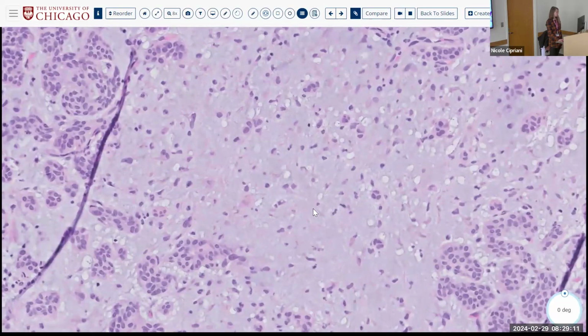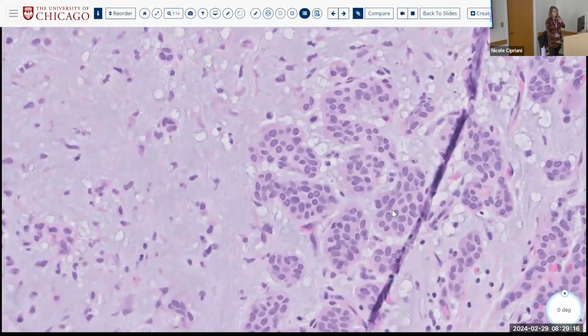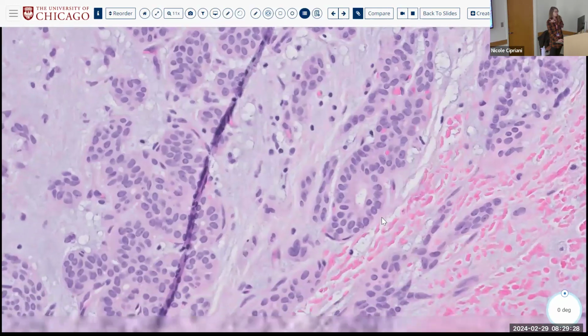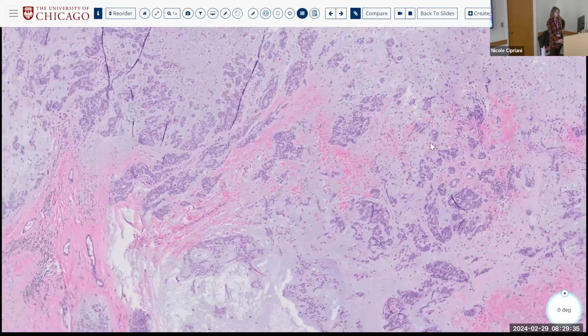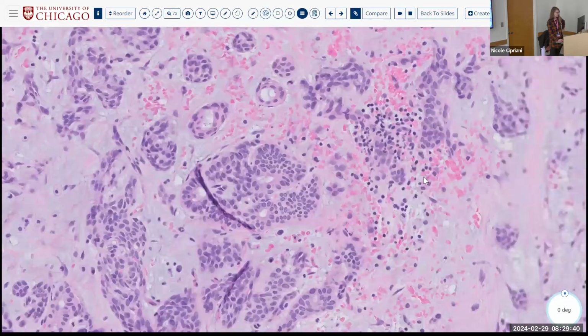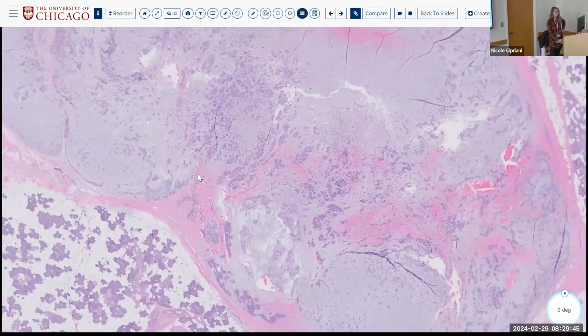Stroma. Yeah, this is a little too much stroma, and arguably too many small solid-ish areas, right? So you really wanna see mostly cysts and ducts, as opposed to, in this case, only occasional ducts, right? Solid. All right, am I making this too hard?